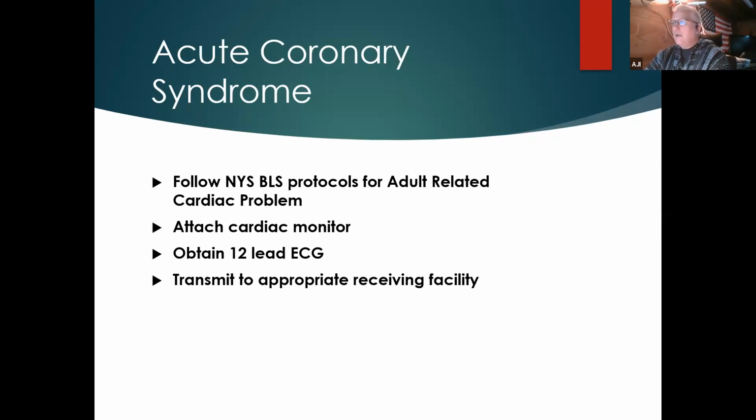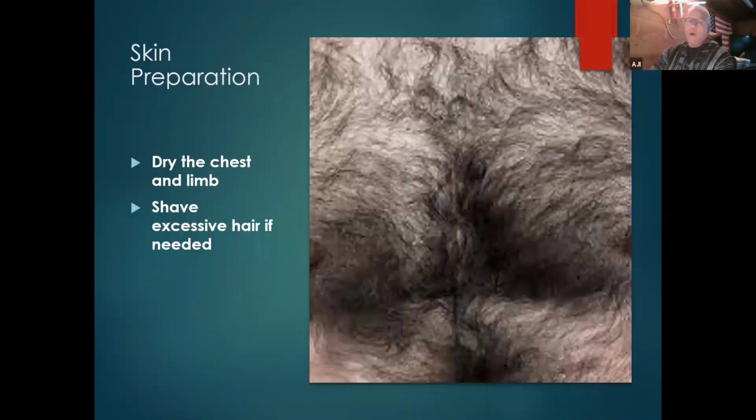So I digress. When we do a 12 lead, it's great. Unfortunately, we don't have a bare skin chest to use all the time. So sometimes, let me rephrase that, a lot of times this may be what you're getting.